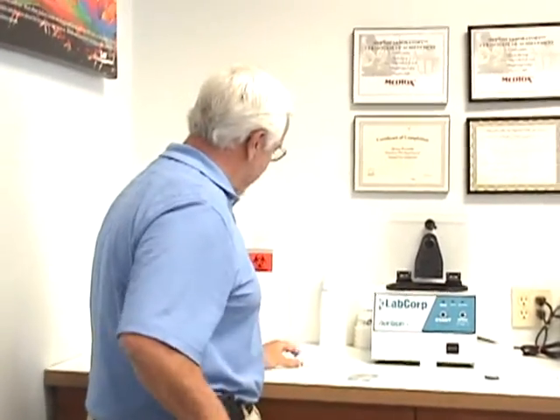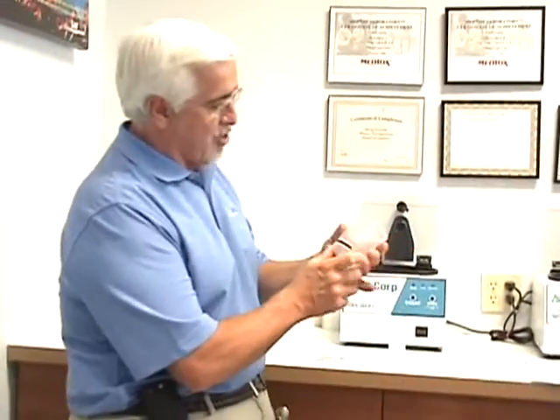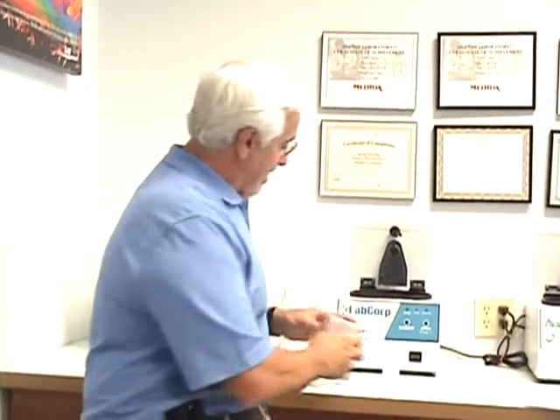What we find, guys, is people who have tried to fake it with devices or adulterants or bringing in somebody else's urine have either microwaved it or heated it up with a car plug-in heater or something like that. By letting this wait that full 4 minutes, we give it a chance to cool down, because if you've heated it up in an artificial fashion, it cools down faster than if it actually came from your body. So while I'm getting everything back in my pockets, I'm going to let that urine sample cool down a little bit, and then we're going to check to make sure that it's between 90 and 100 degrees. At that point, these little things get snapped open.